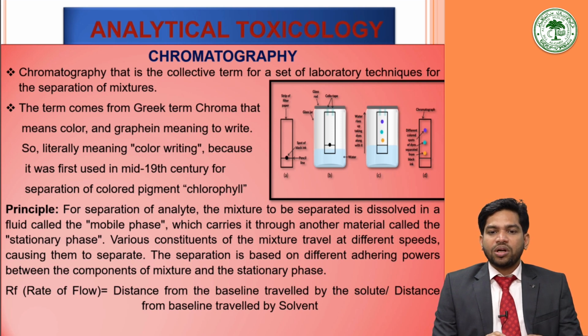Rf values don't have units since they are a ratio. Every compound has a specific Rf value for every specific solvent and solvent concentration. A compound will have different Rf values for different solvents, and by this we can identify the exact compound.